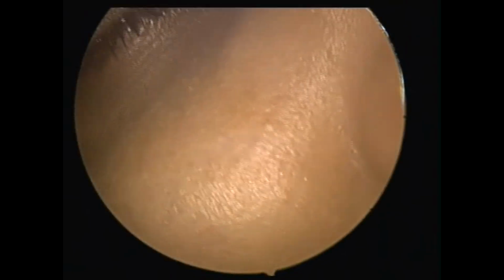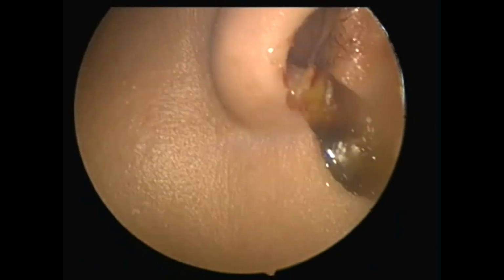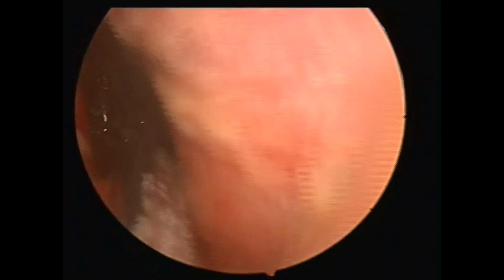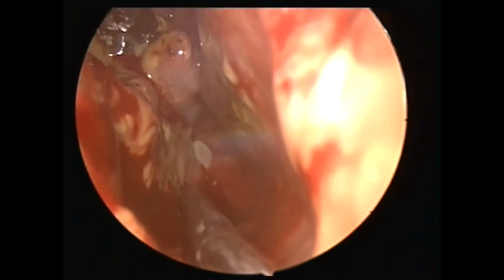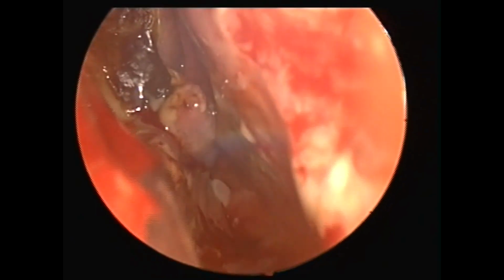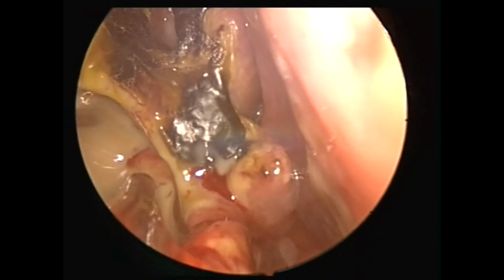This was a patient of AFRS and started on severe, vigorous nasal washes, but still the patient landed up with severe crusting in the anterior aspect and a lot of mucoid entrapment inside. As you can see, I'm just trying to remove all that scab formation, the crusting. The surgical video of this patient is also on my YouTube channel, and this is day 15 of that patient. You can see this is the patient's right side maxillary sinus.